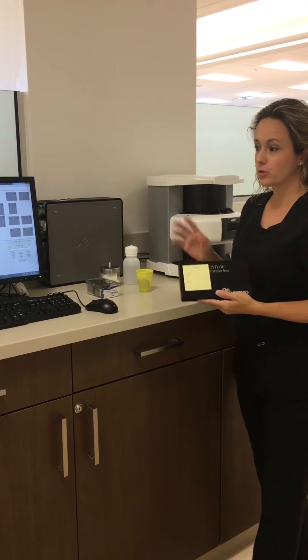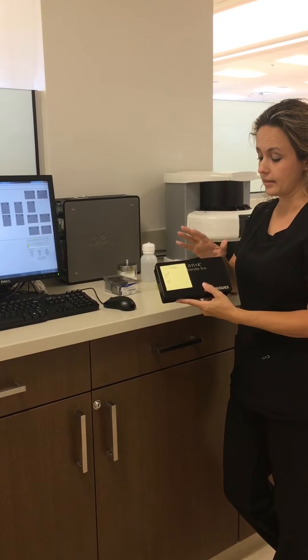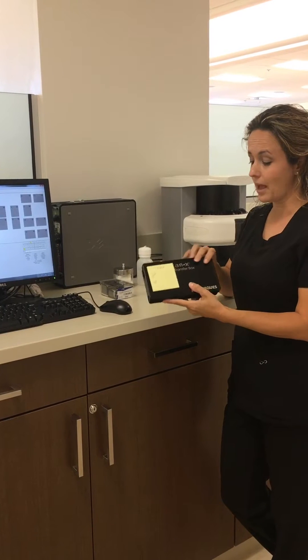After getting your prescription for your radiographs from your dentist, you are going to check out the ScanX PSP plates from your professor. You will be given your films in a black box.